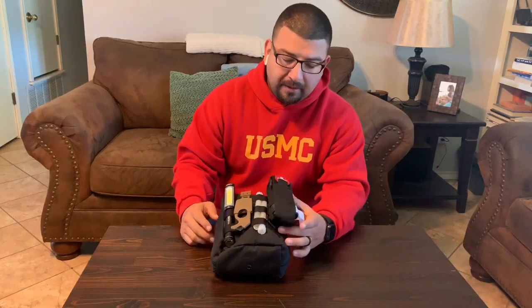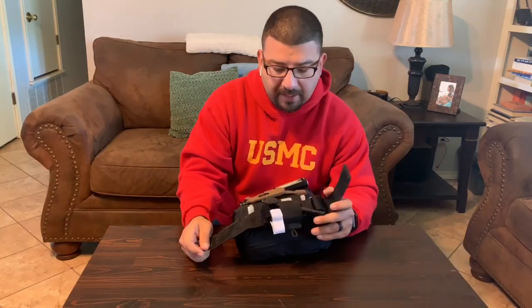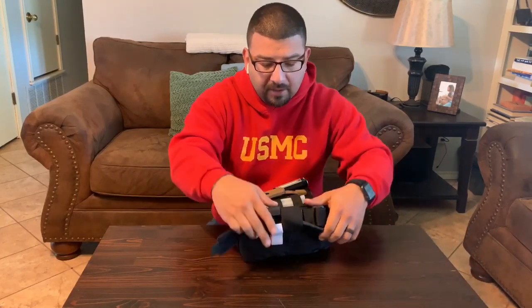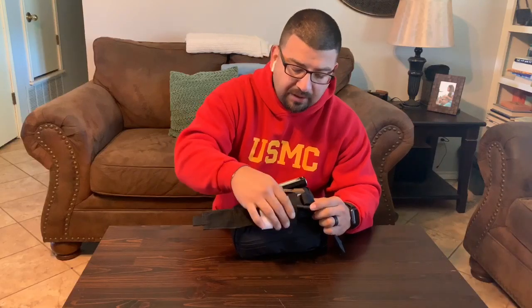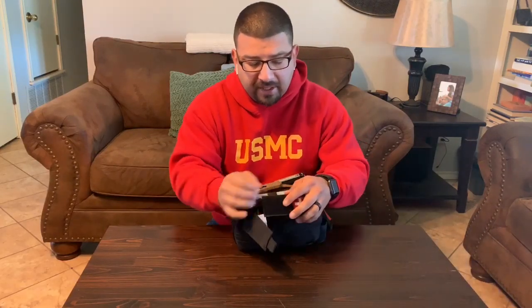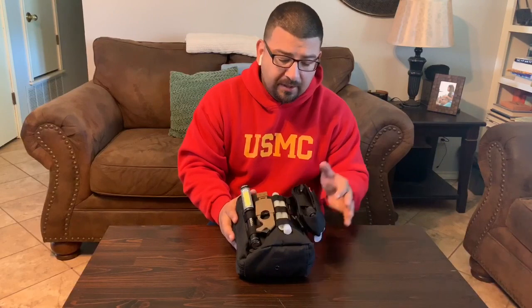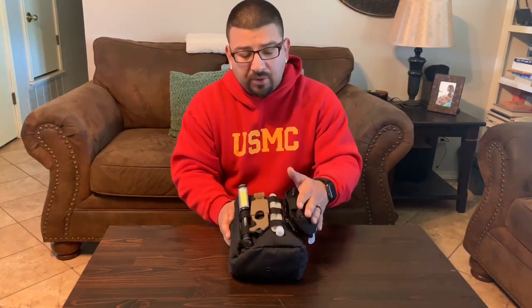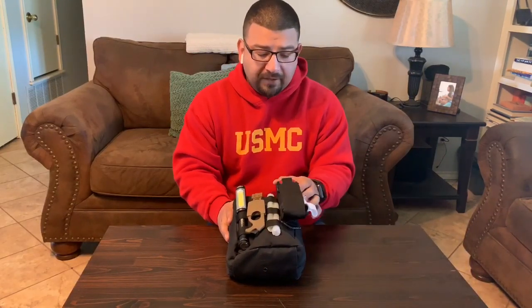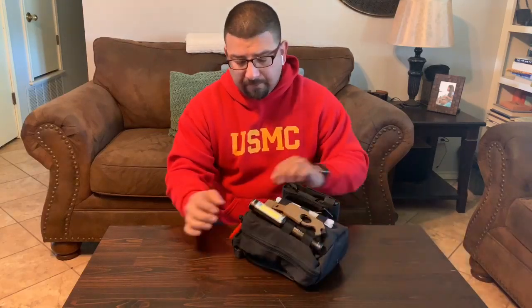On this side we have my tourniquet. It's a CAT tourniquet. All you do is pull this down right here, it comes apart, and the CAT tourniquet is just held on here with this little elastic band. So very simple, very easy to get to, very easy to use. I have multiple types of tourniquets, but this is just my favorite one. This is what I used when I was in the military. I found this little CAT tourniquet holder and I just thought that was really cool, very functional.